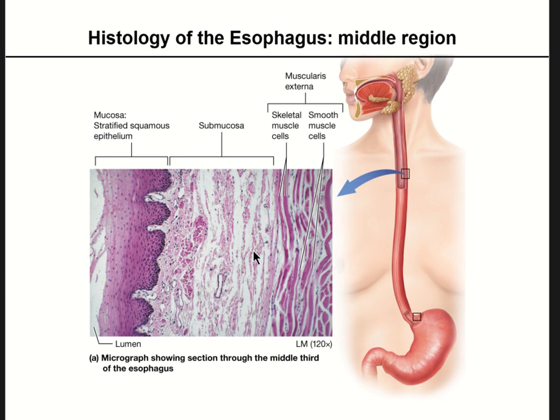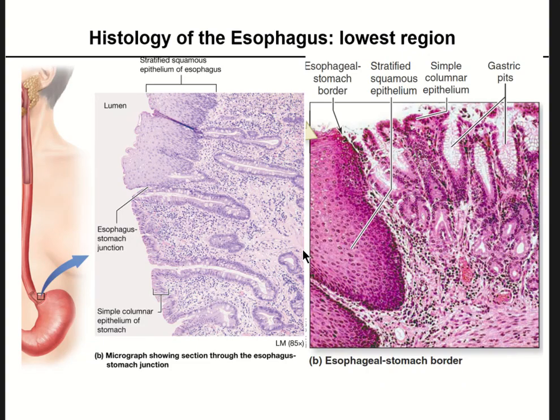And don't forget, you can definitely tell this is your mucosa, but for the difference between your submucosa and your muscularis externa, remember, you're going to have a lot less interstitial space. You can think about it like this is your Kroger bacon, and this is your Whole Foods bacon for the super, super healthy people.